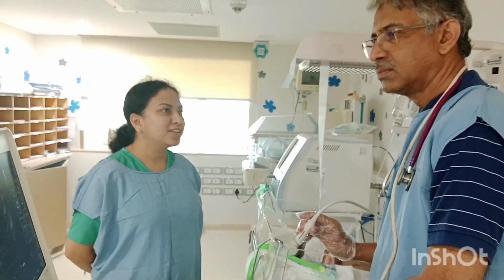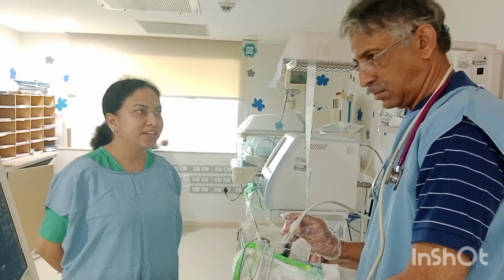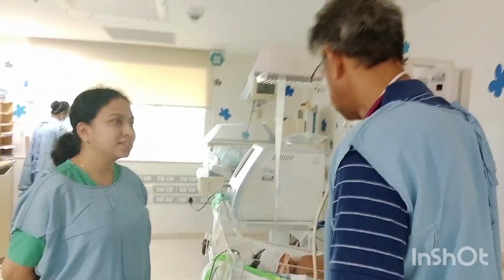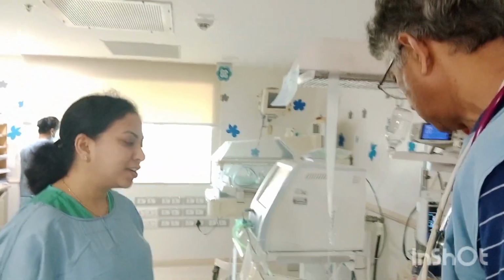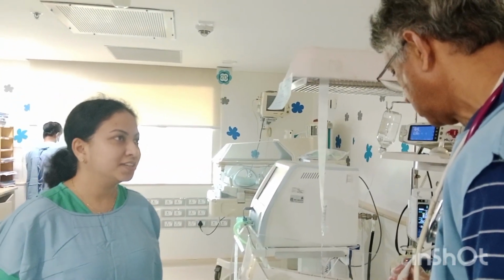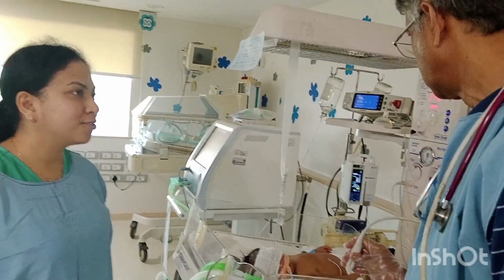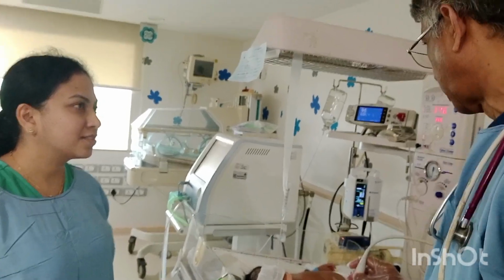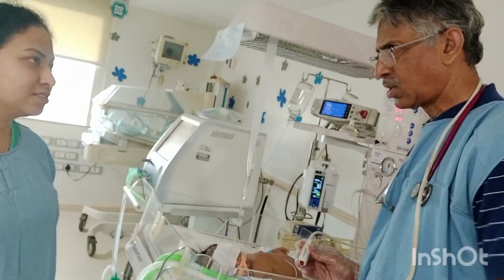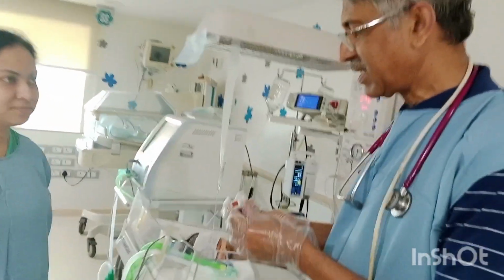Here is a baby born at term, with a large for gestational age, intubated on day 1. It is requiring persistent respiratory support with a history of recurrent pneumonia. Referred here on day 14 of life for evaluation of respiratory distress. We wanted to know what are the two echo evidences for the cause of respiratory failure. Most of the times, these babies are diagnosed as different pneumonias. So let us see what exactly this baby has got.